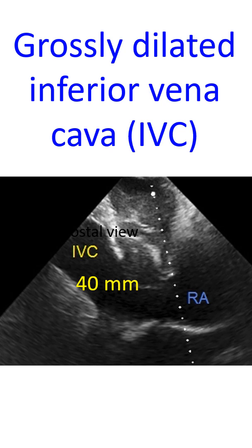Grossly dilated inferior vena cava on echocardiography from the subcostal view is seen in this image. The subcostal view with a tilt images the inferior vena cava draining into the right atrium. Here the IVC is grossly dilated with a diameter of 40 mm, indicating severe right heart failure. When IVC is dilated very much, it is customary to add 20 mmHg to the observed tricuspid regurgitation gradient while estimating the right ventricular systolic pressure.